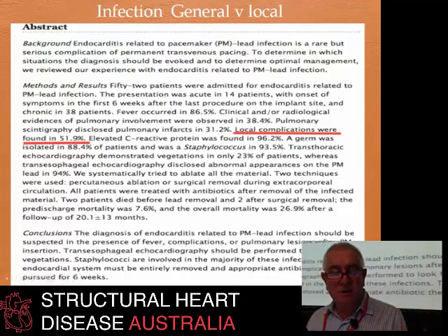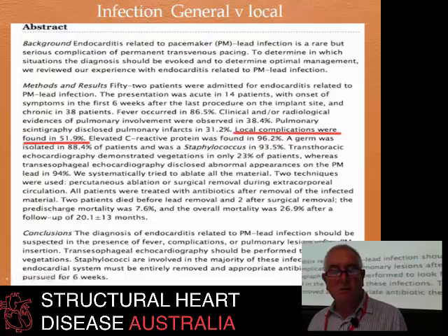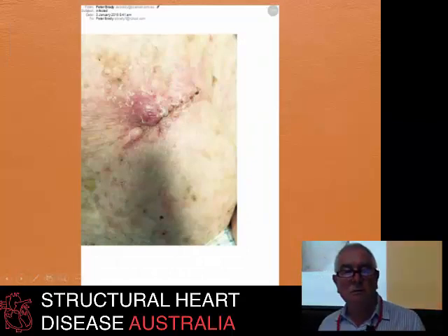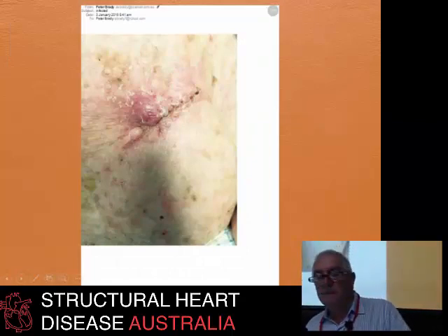So even though these patients had infected pacing systems, there was only external evidence of that in approximately half the patients. Interestingly, transthoracic echo demonstrated vegetations in only about a quarter, whereas TOE increased that number to pretty close to 100% when they were present. So I think it speaks volumes for having a thorough investigation of these patients, which would include transesophageal echo.